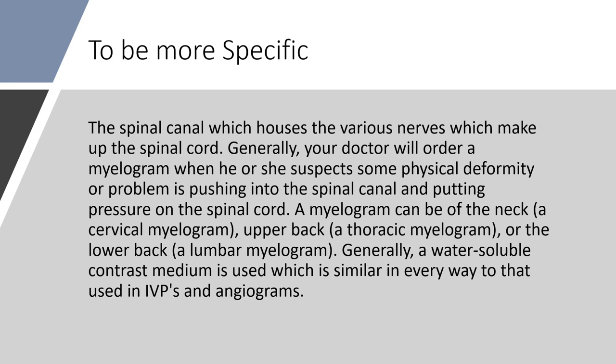A myelogram can be of the neck, a cervical myelogram, the upper back, a thoracic myelogram, or a lower back, a lumbar myelogram. Generally, a water-soluble contrast medium is used, which is similar in every way to the dye used for IVPs and angiograms.